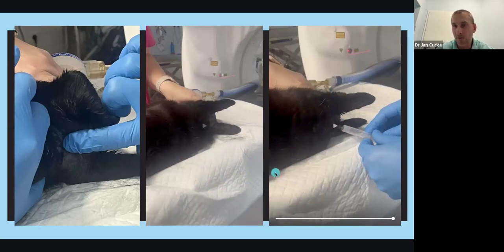It could also be from the caudal puncture, and that's what most people are afraid of when doing myelography. That's some kind of seizures after myelography. It could happen. It's not something strange. It's some kind of adverse reaction to the contrast medium, and you should be prepared to solve this problem.